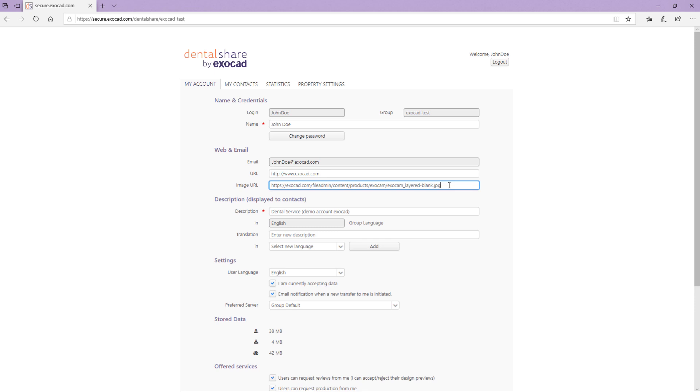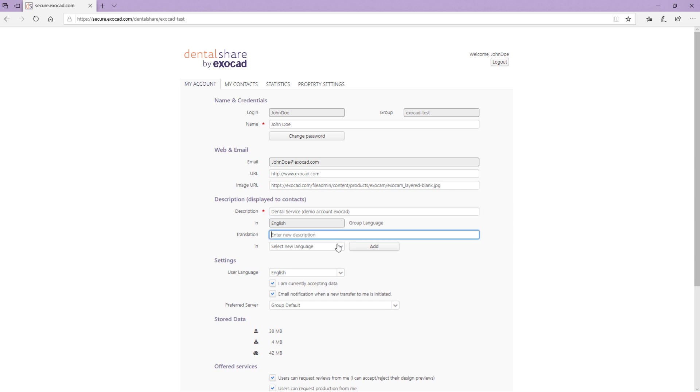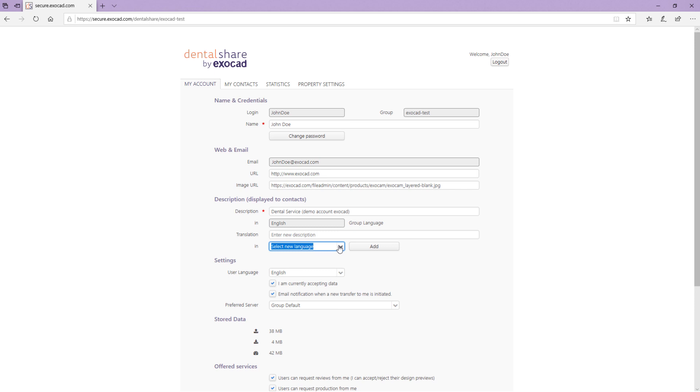You can enter a description for your laboratory or dental practice in settings. For partners with a different language, you can enter a translation for your description text in the translation field and add it to your description.